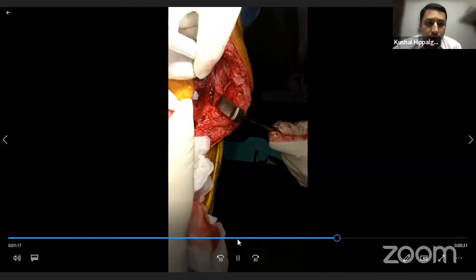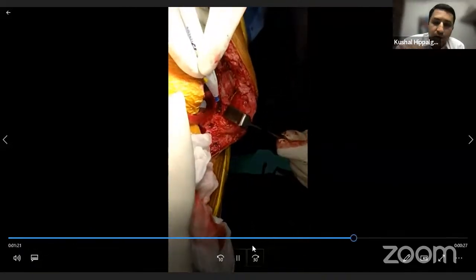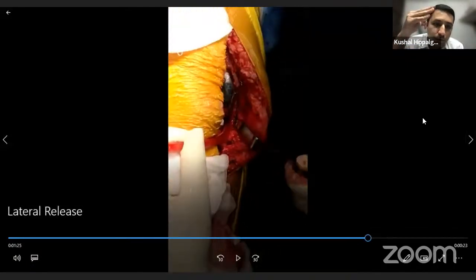So the only caution here is if you see the cautery tripped, you don't have a control as to if it's going through and through versus if it's protecting the outer, the capsular layer. So a better way to do it is just nick it with a knife, put your scissors through and ensure you go between the plane of the capsule and the retinaculum and then cut the retinaculum and try to maintain the capsule intact. But sometimes it's so tight, you have to actually do a through and through release.